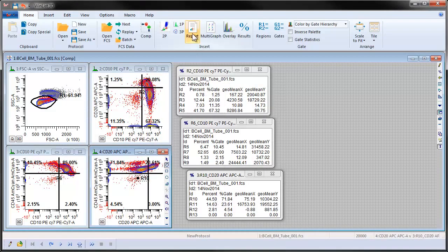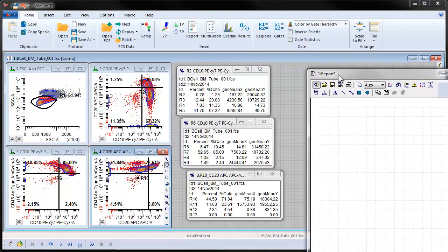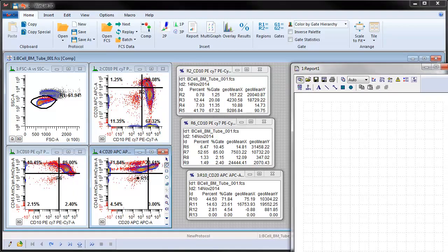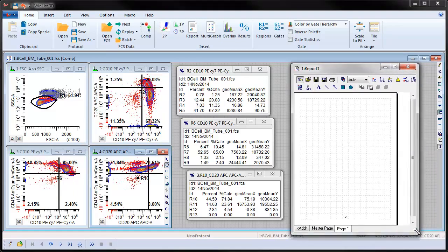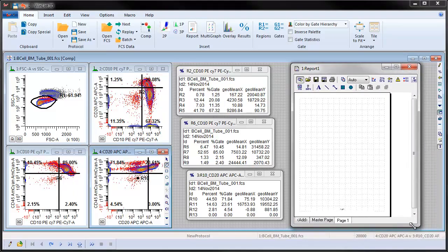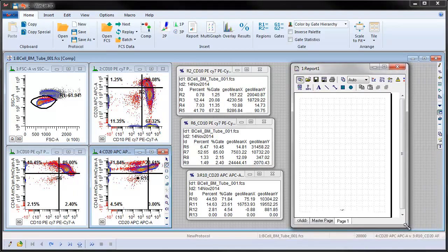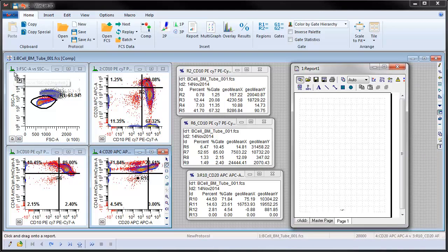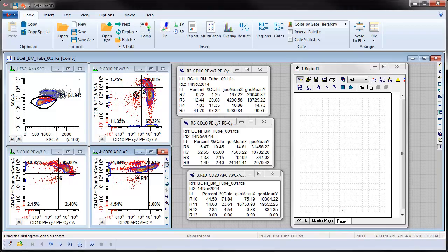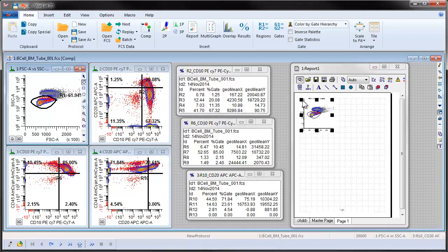Click the Report button on the ribbon bar and resize the New Report window so that it is not covering histograms or results. On any of the histograms, move the mouse over the icon on the left side of the title bar and drag it onto the report space.